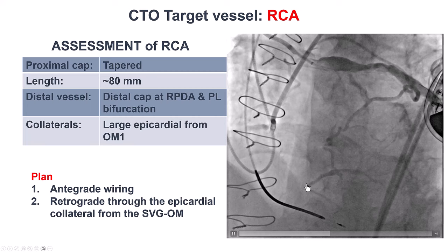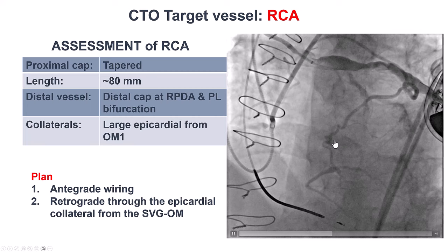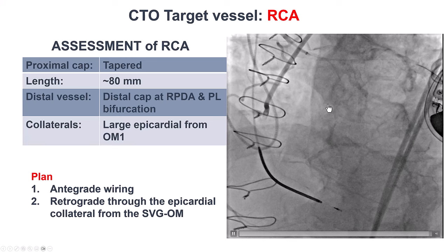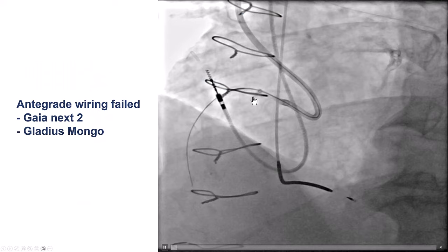Given the risks associated with retrograde PCI through epicardial collaterals, especially in bypass patients that carry the risk of loculated effusions in case of collateral perforation, we decided to first try antegrade wiring, and if that failed, to then attempt retrograde through the epicardial collateral. Antegrade wiring was not successful.